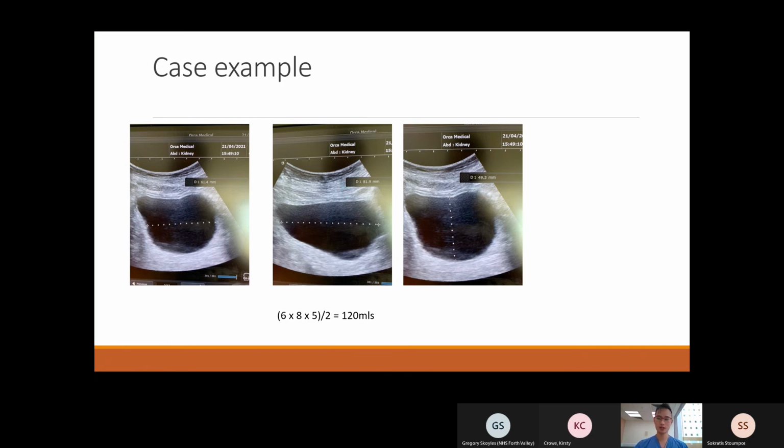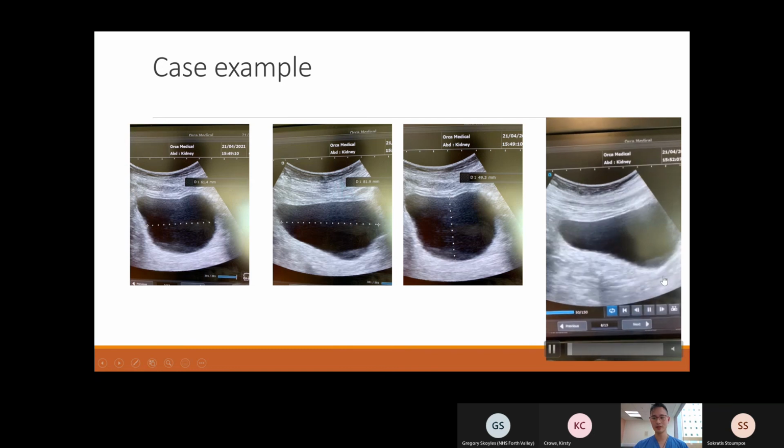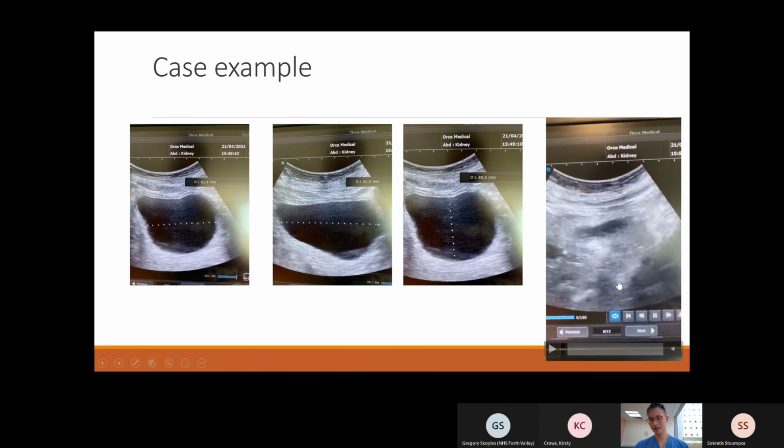Now, in this case, I'm showing this image not only to demonstrate that, but if you look carefully at the bottom of the image in the bladder, you can see this grayish area, this slightly hyperdense area compared to your normal urine. You can see that. And I've got another image of me fanning through it. You fan through, you can see that there is something underneath there.